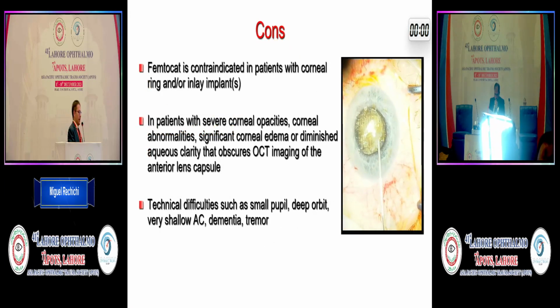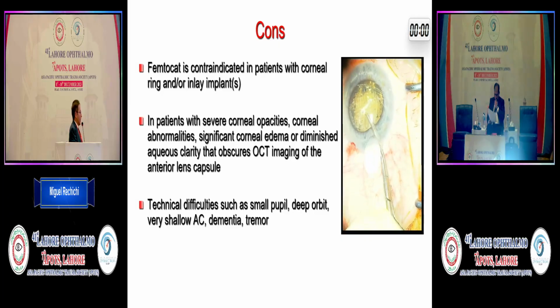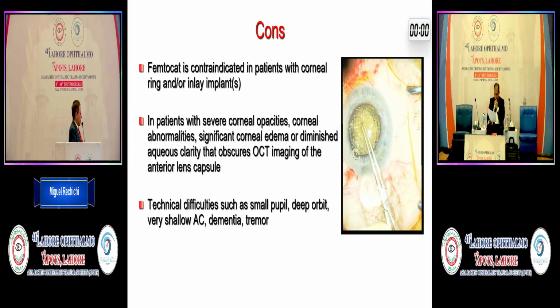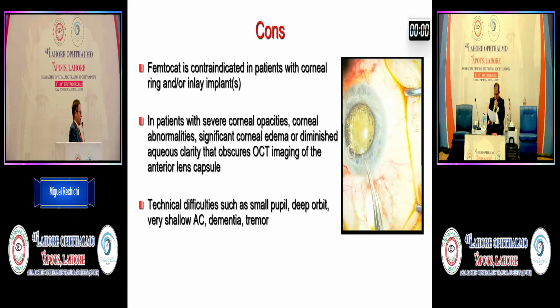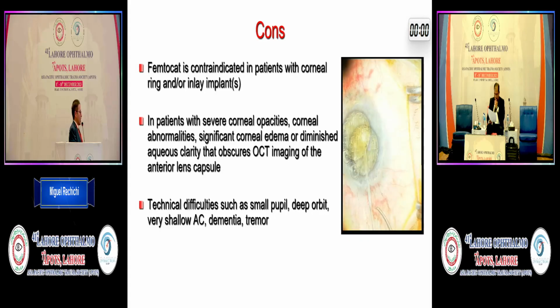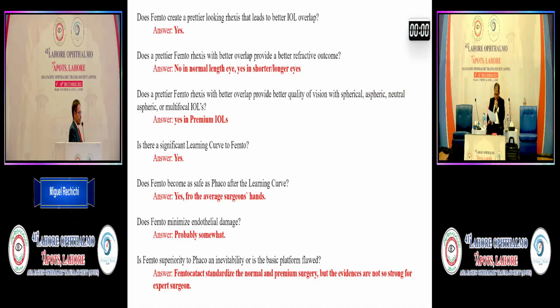And to me, the worst fault of a femtosecond laser is that it will not help you in a patient who does not dilate very well, in a patient who has a small pupil, deep orbit, and very shallow anterior chamber. So it will not help you in very challenging cases. So this is the answer to a lot of questions that people usually ask the femtosecond cataract surgeon.